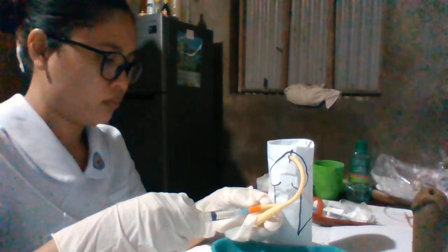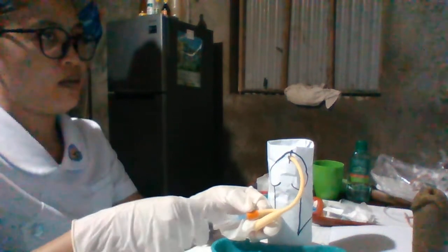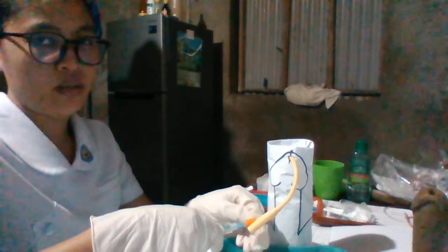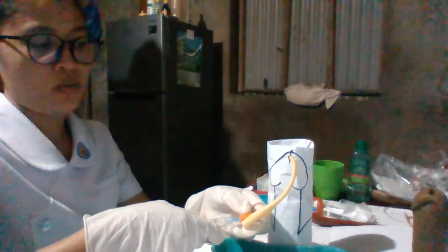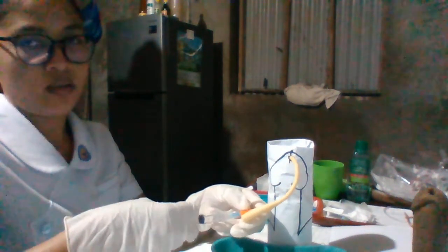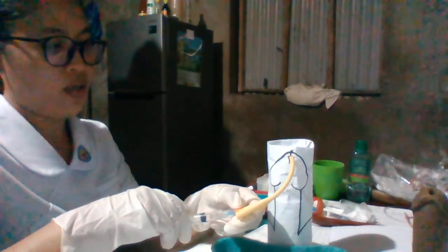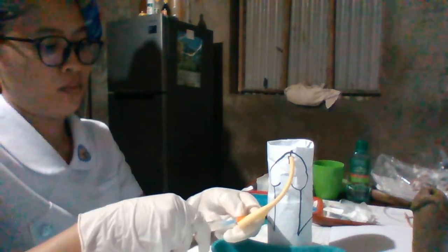Afterwards, after the solution is injected, we're going to remove the syringe if the right amount to inflate the catheter is already in it.